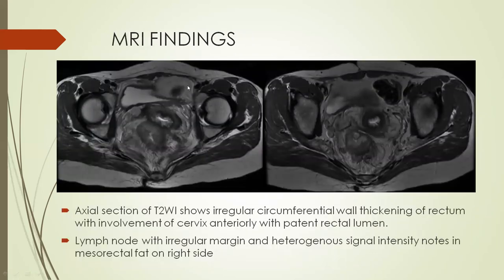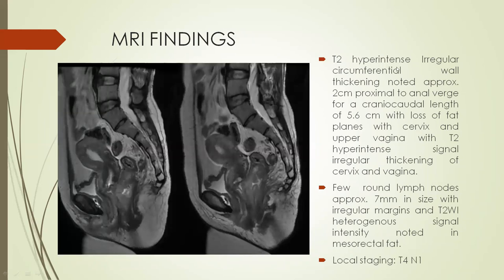On MRI, T2-weighted images show circumferential thickening of the rectal wall with involvement of the anterior wall of the cervix anteriorly. However, the lumen of the rectum appears patent. Few lymph nodes with irregular margins and heterogeneous signal intensity are noted in the mesorectal fat on the right side. On sagittal section, T2-hyperintense irregular circumferential wall thickening is noted approximately 2 cm from the anal verge for a length of approximately 5.6 cm, with loss of fat plane with the cervix and upper vagina anteriorly. Few round lymph nodes with heterogeneous signal intensity and irregular margins are noted in the mesorectal fat, which are suspicious. The local stage of CA rectum was determined to be T4N1.